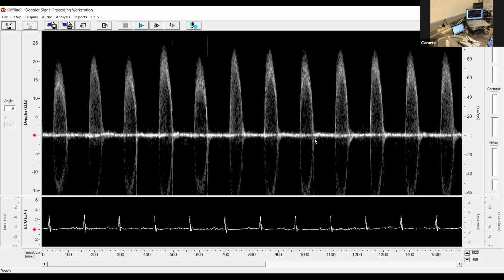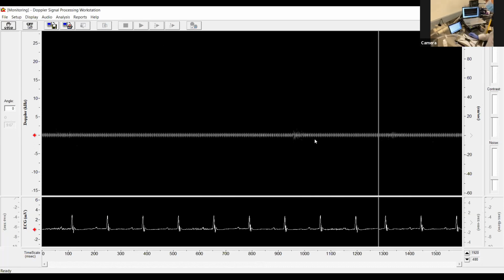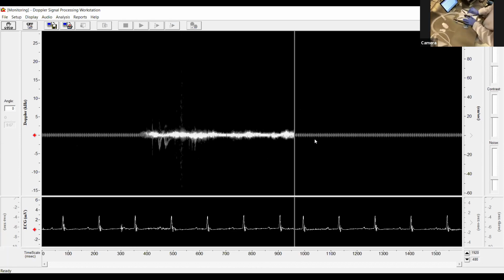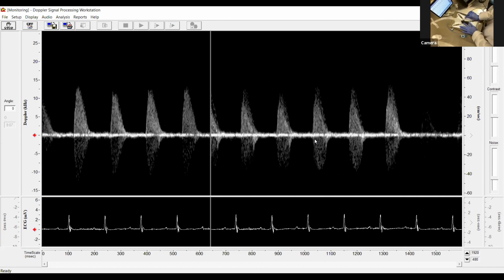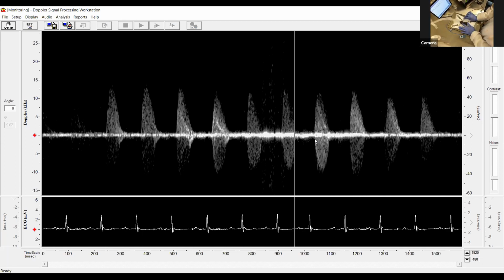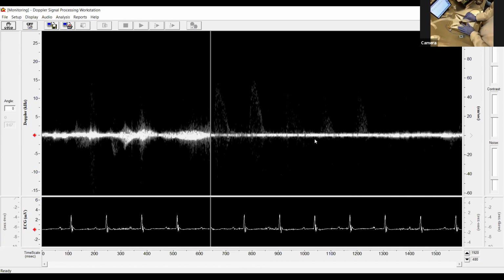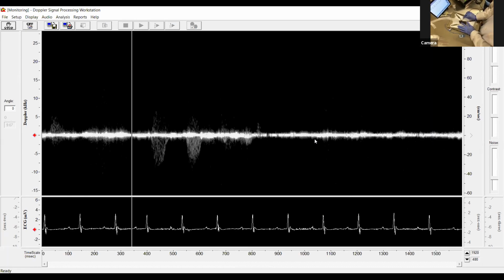Okay, so now we want to move to aortic arch. Perfect. A little bit further down the vascular tree. The last image that we took was from the ascending aorta, at the aortic root. Here we would be taking a measurement from the aortic arch, so we'll see a little bit of a difference in shape. If you had a TAC model, you could use this to look at the velocity through the stenosis, and an approximation of the pressure across that stenosis can be made using Bernoulli's equation.